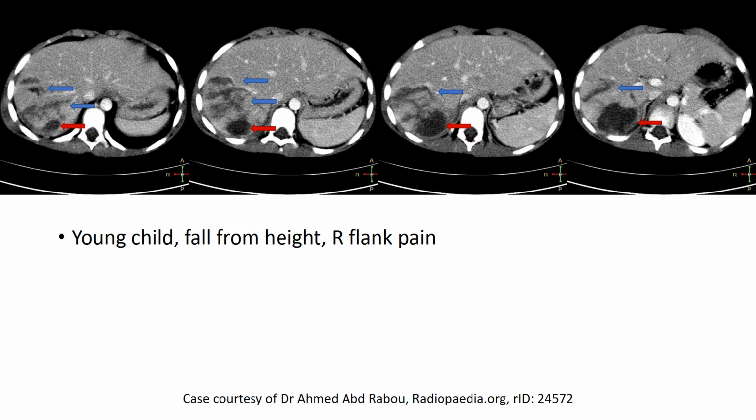Now technically this is probably a grade 3 injury, but I think it's pretty irrelevant. The main thing is to show that you can demonstrate the major abnormalities and use your intuition to guide how serious an injury it actually is.